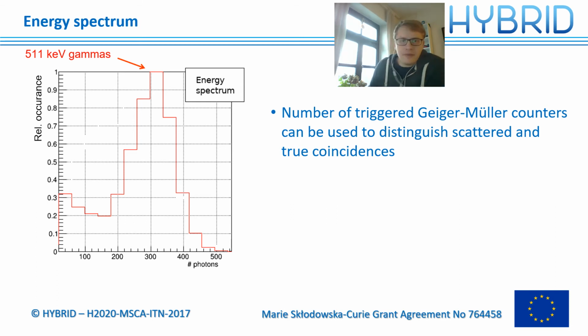However, as you can see, it is not always that we just measure 300 something, which corresponds here to the maximum peak. So it's not always like 320 photons we measure if one 511 keV gamma particle comes in, but we measure something with a certain width. And this is problematic because right here we can be sure that we have Compton scatter.